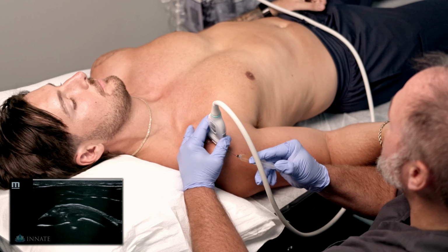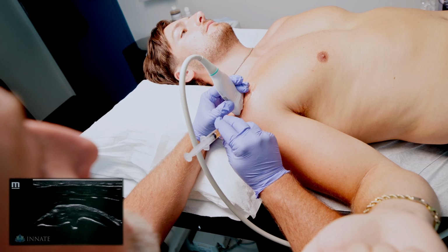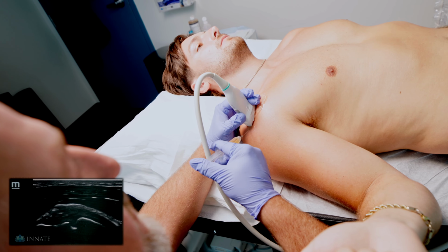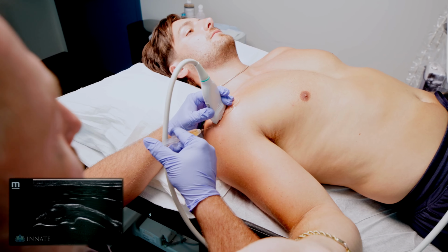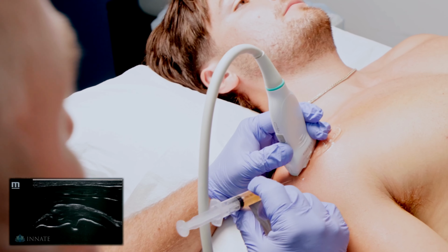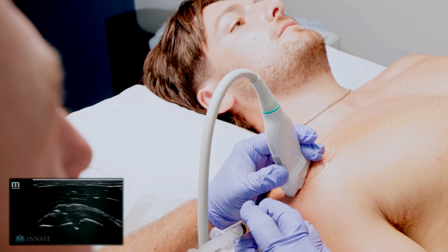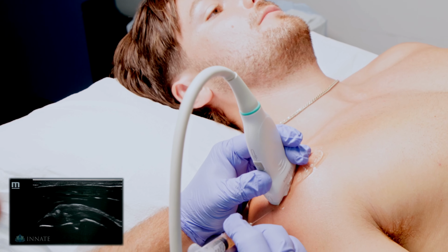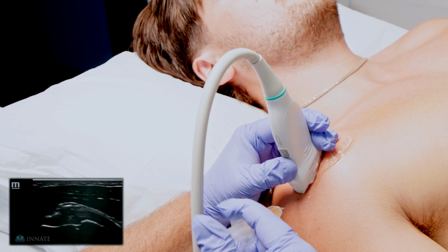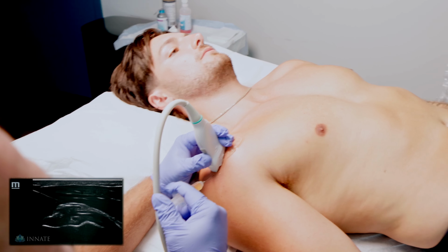It's a very tight space, even though we do see that change in echogenicity that we have here. I'm just going to do a little bit of fenestration again here, allow some of those cells to spread. And we'll give you a few more seconds here. Just a little bit more fenestration. And just tapping that cortex a little bit on time. And now some more of the cells are going in.